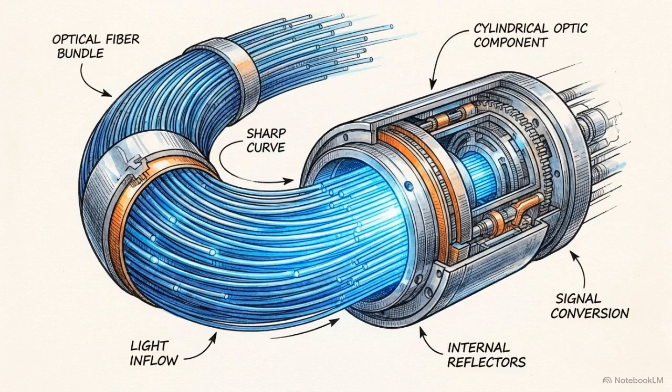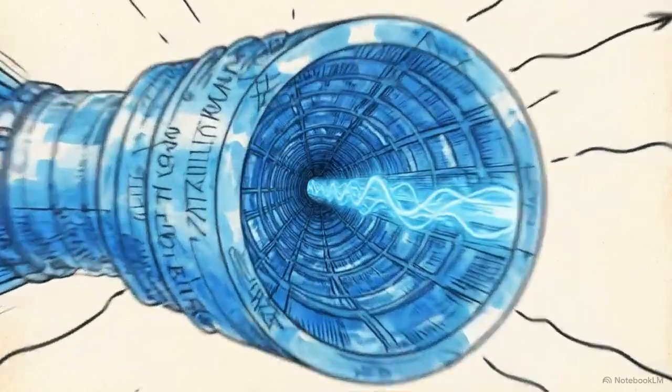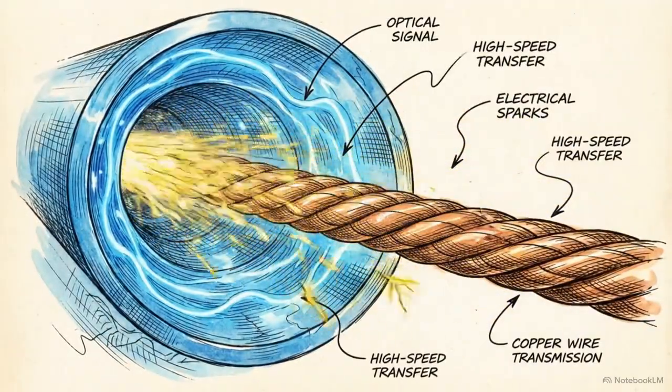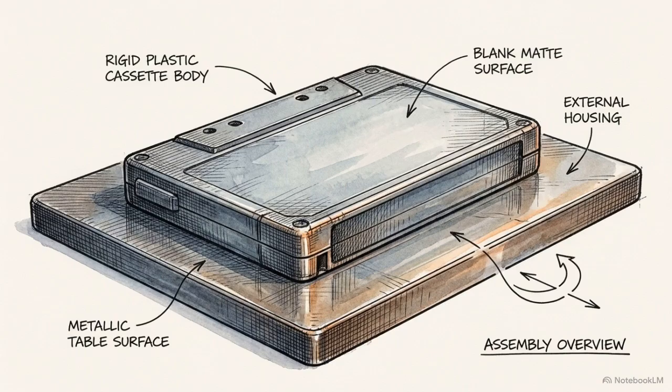To extract data, a red laser beam scans the plate, knocking the electrons back to their ground state and forcing them to release stored energy as visible blue light. The released blue light is collected by optical fibers and fed into a photomultiplier tube. The tube amplifies the light, converts it into an electrical current, and sends it to the ADC to be digitized. Because the electrons have returned to their ground state, this readout process is destructive. The latent image is eliminated.